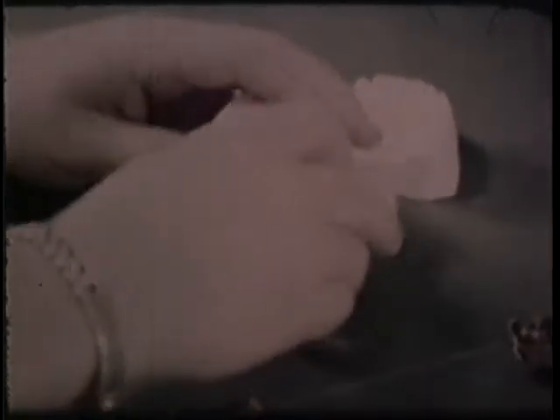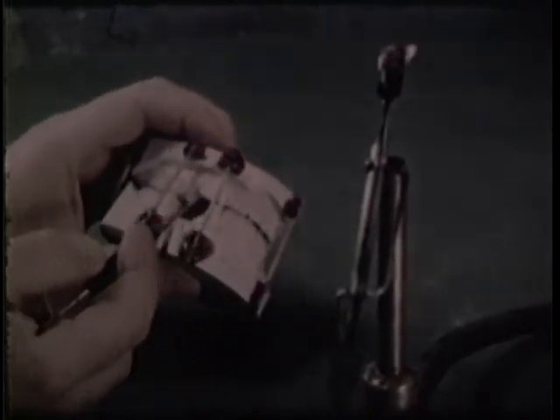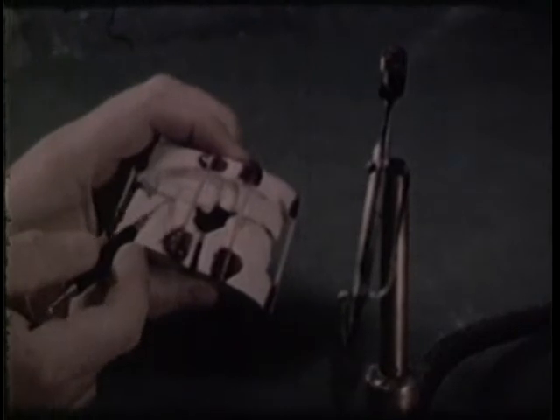Working models are obtained by duplicating the master models. Then the lower model is separated by sawing through the fracture line, so the casts can be mounted on an articulator and the former occlusal relationship of the teeth obtained. Master models are kept intact for further duplication in case of inadvertent miscalculation. The separated portions are then reassembled in the original relationship of the lower teeth to the upper teeth; the facets of the teeth serve as guides. The gap in the lower jaw marks the site of the non-united fracture.